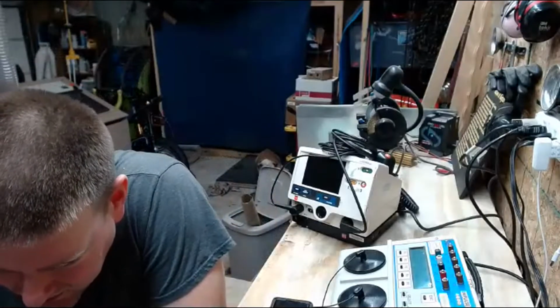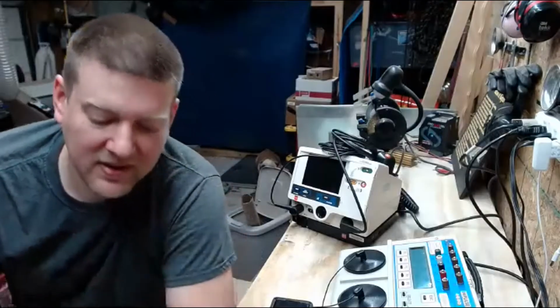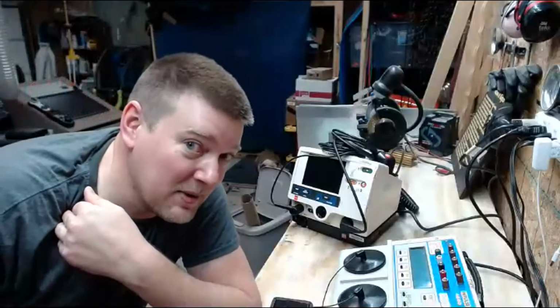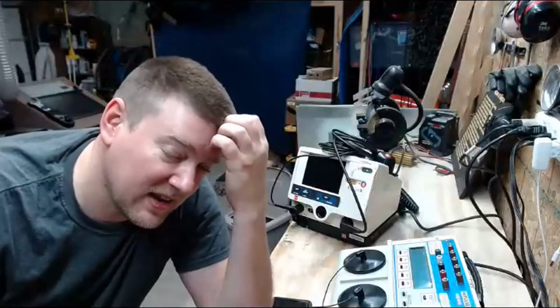Let's see. What else can I say? Date and time on life support equipment is paramount. Date and time. It's so important, guys. I cannot stress that enough. I am the guy that has to come in every time there's an hour change for the daylight savings. So trust me, we have to go through all these devices and set the date and time.